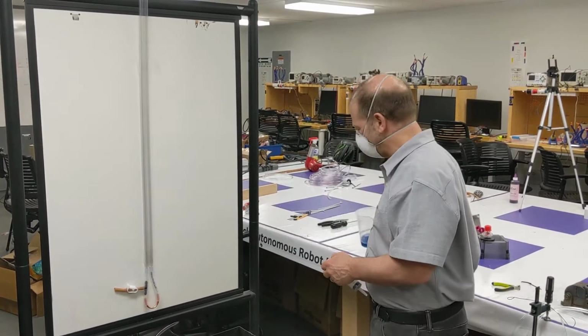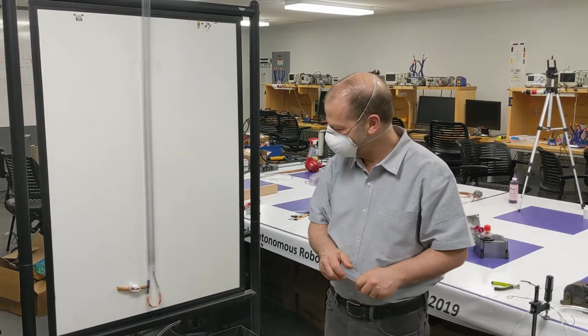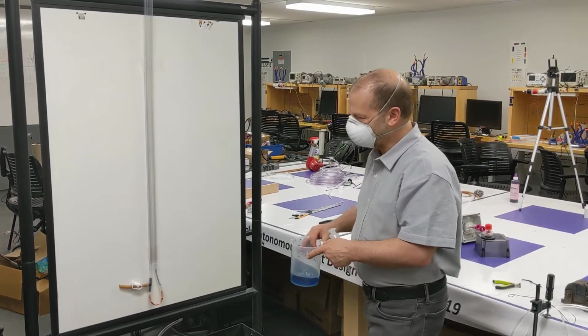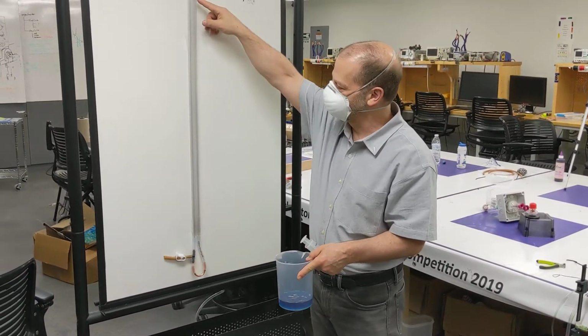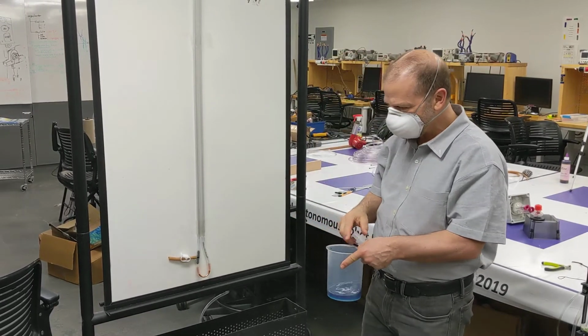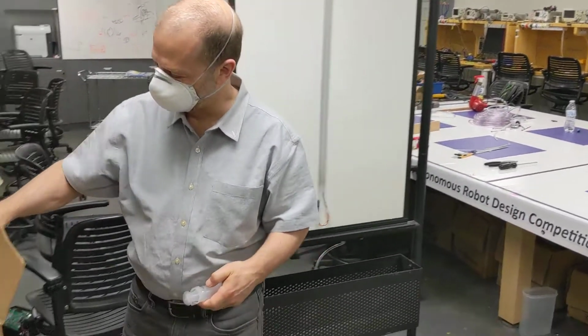Okay, so this is the purple manometer. It's going to be blue today. I'm about to fill it. I have diagrammed all the steps of construction of this thing. It's just a simple, what they call a U-tube manometer. And let's fill it up.